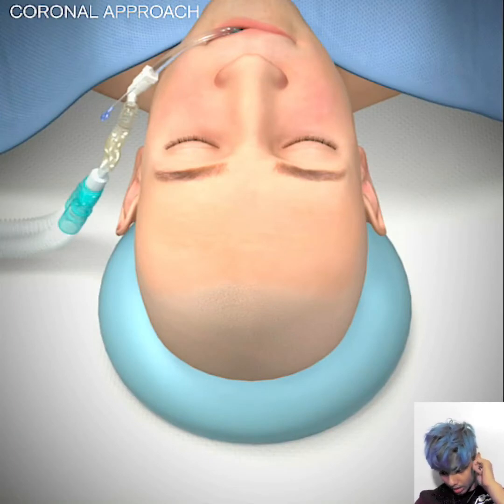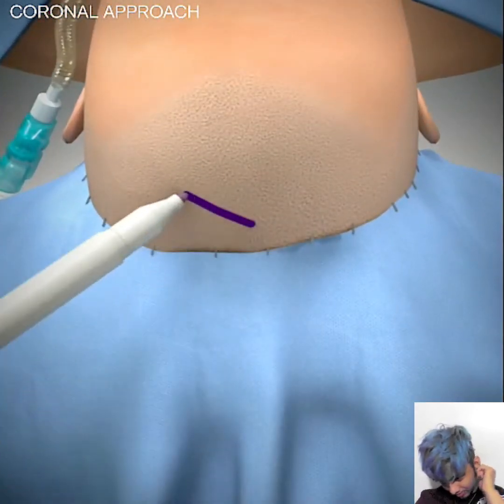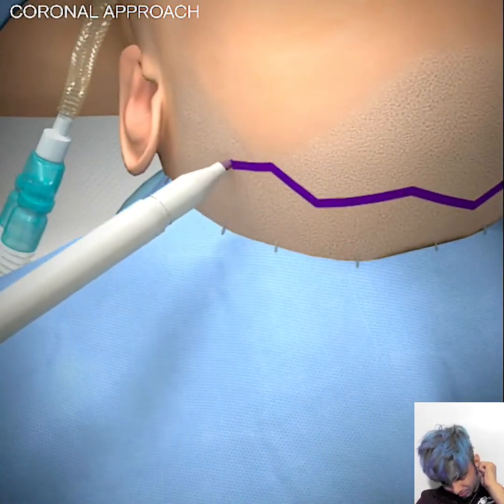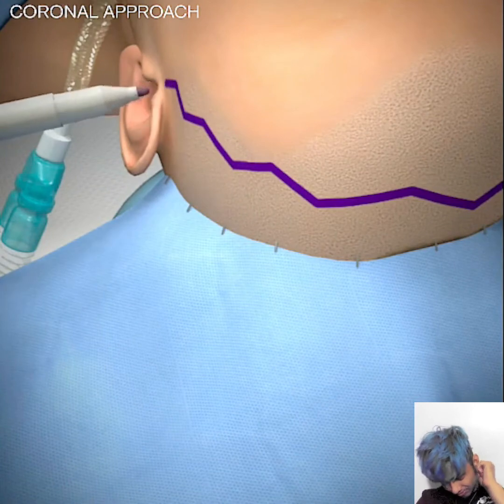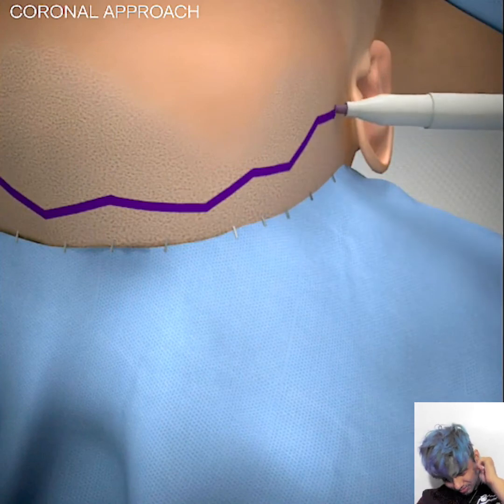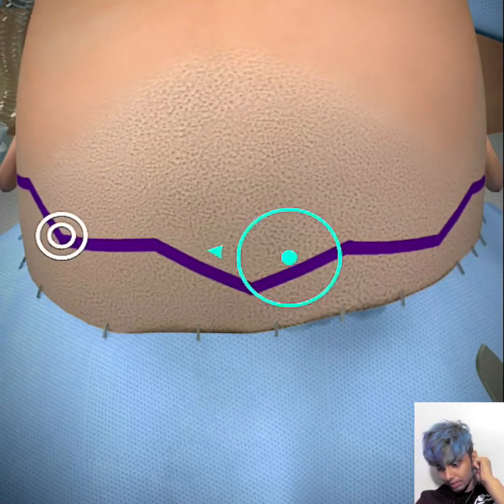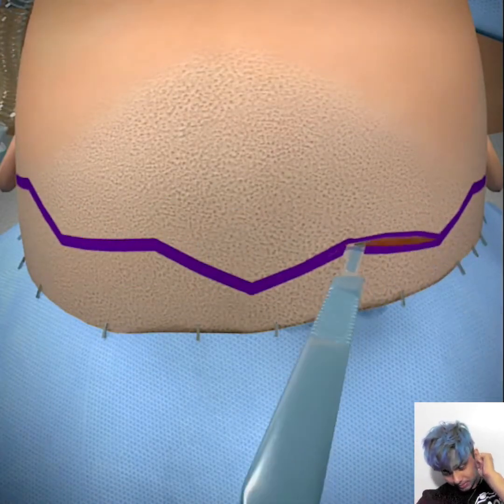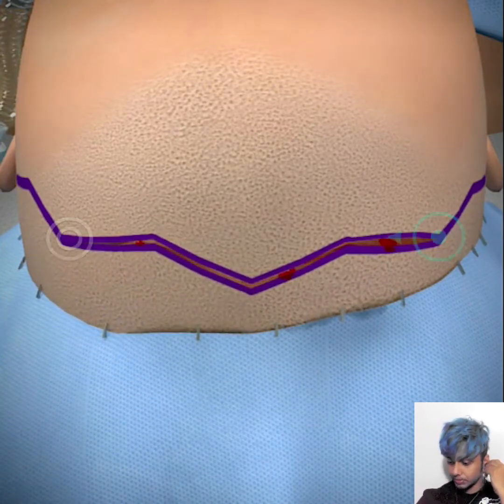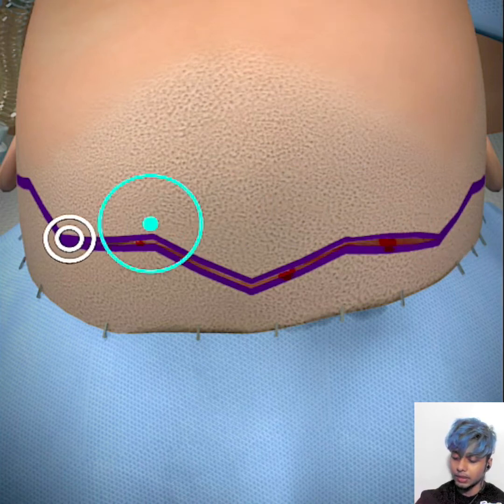We'll staple a drape to the skull posterior to the corridor of incision. We'll select a number 10 to 15 blade. We'll continue the dissection anteriorly 2 to 4 cm in the subgaleal plane.